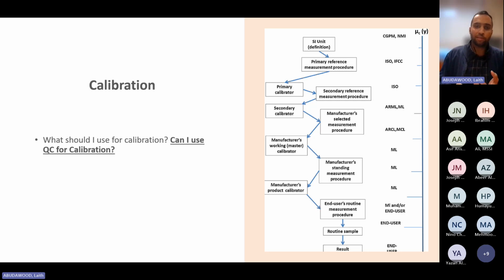So when I say calibration is traceable, I mean that there is a chain of calibrations that connects me to the WHO reference. Now, this is something very important in calibration, because this means that my machine is as close as possible to what's truly in my sample. We call this traceability. Now, many of you, of course, have heard from your customers, can I have the traceability certificate? I want you to give me the traceability certificate. Where is the traceability certificate?